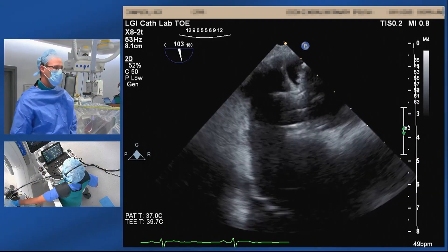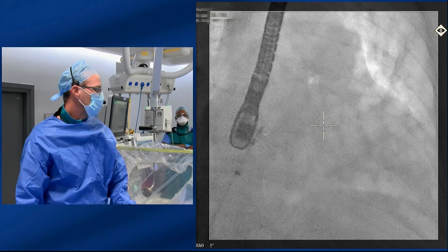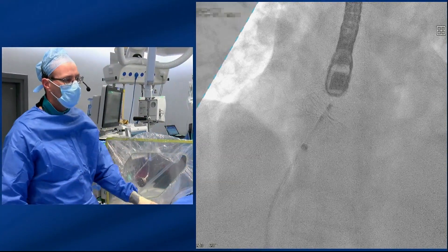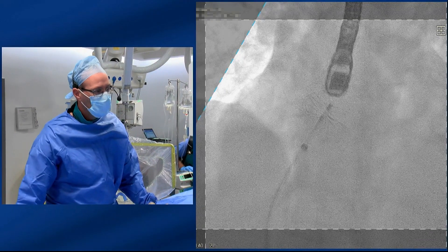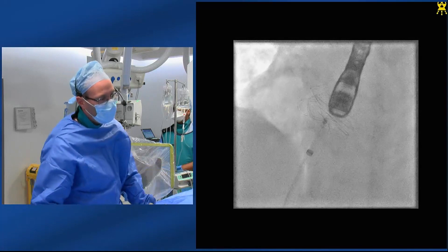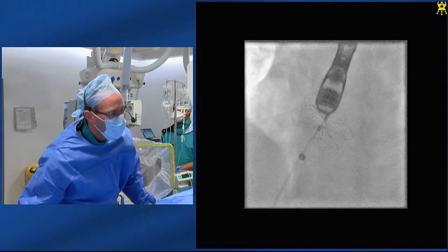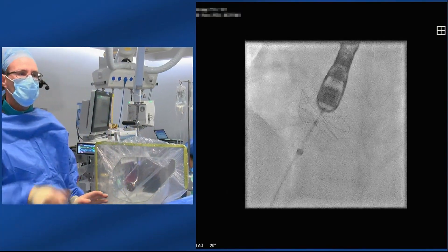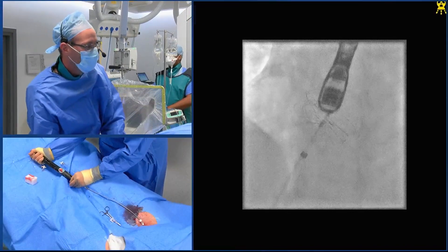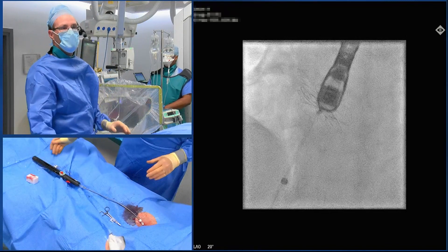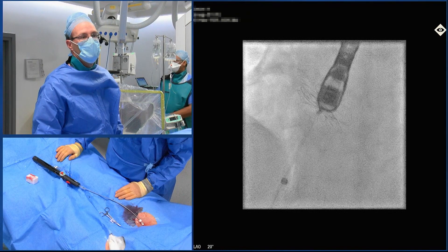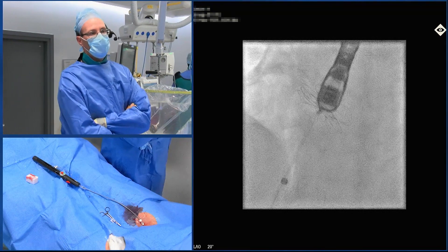On fluoro, going LAO cranial and zooming in — we want to see that the discs are symmetrical, that there's no bunching of the wires, and that there's good separation between the left and right disc. Coning in on the fluoro image, we should be able to see good separation both superiorly and inferiorly, and the discs look symmetrical without overlap of the wires. I'm comfortable locking the device now — it will reorientate itself to the natural position of the septum.